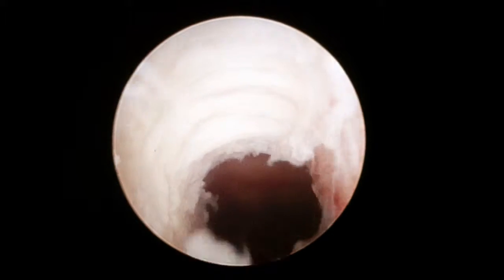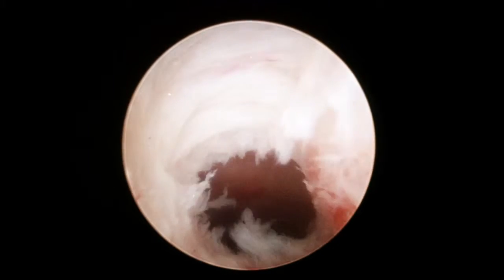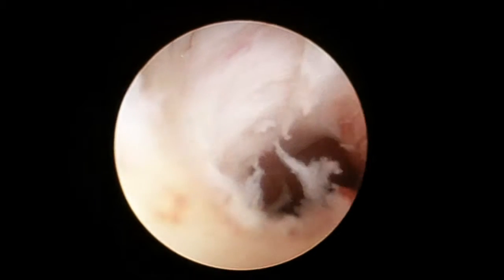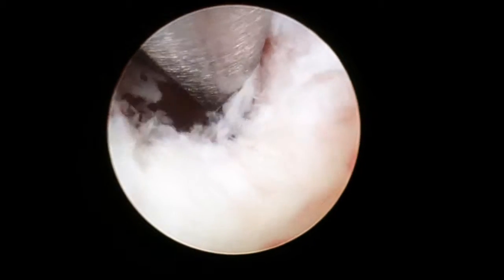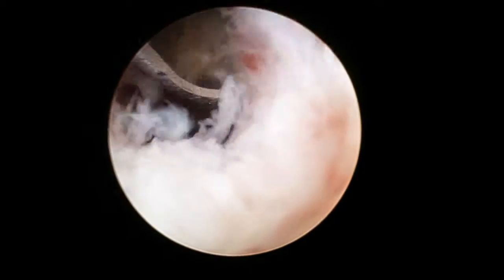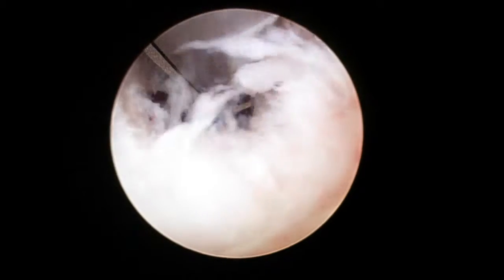The Aqualex fluid control system was used for fluid management throughout the procedure. The intrauterine pressure was set at 80 mm mercury. Typically with adhesiolysis using cautery or scissors, I increase the intrauterine pressure to more than 100 mm mercury in order to put the scar tissue on tension to facilitate dissection. Lower uterine pressure settings may reduce the likelihood of fluid intravasation and fluid deficit.